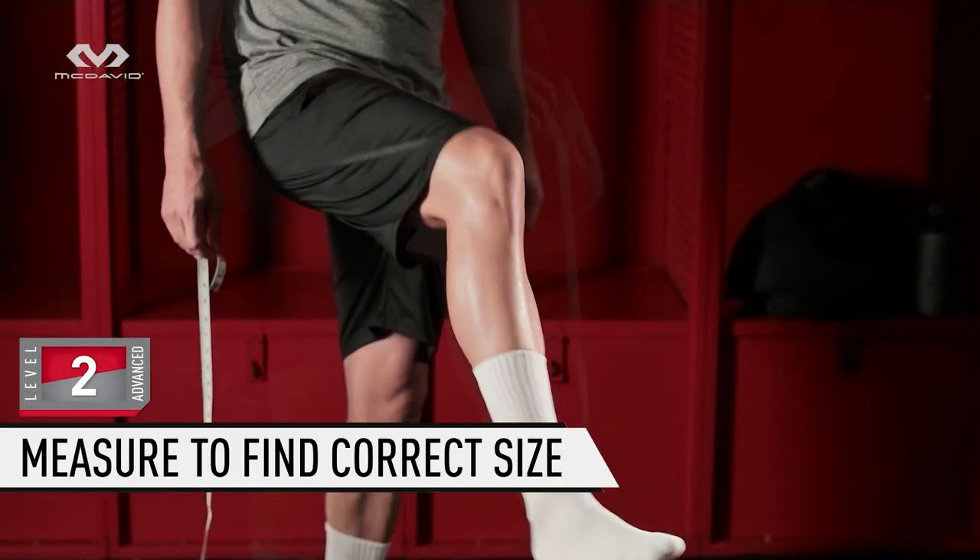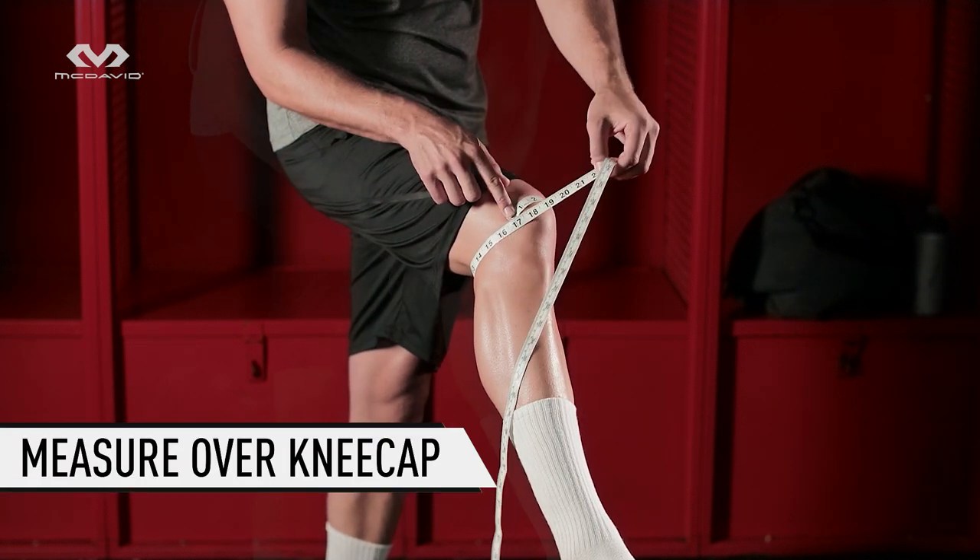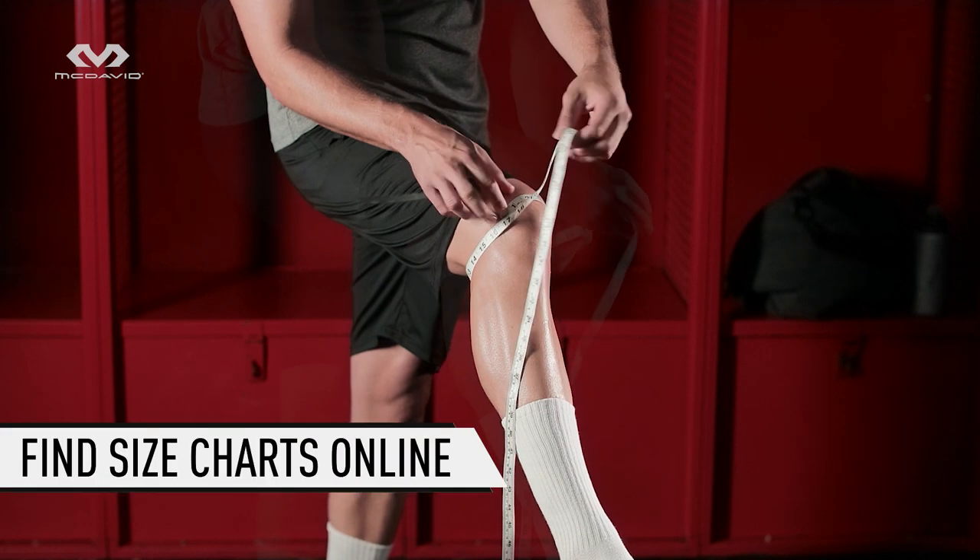Stand and bend your leg just short of 45 degrees. Measure the circumference over the kneecap. Compare your measurement with our size charts online or on our packaging.